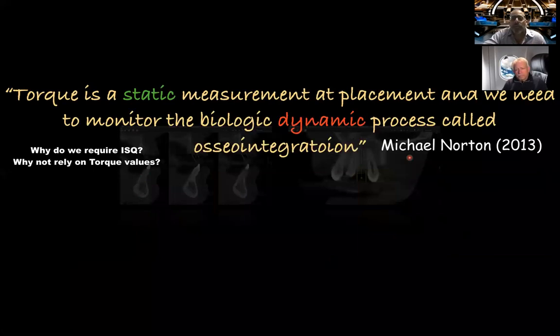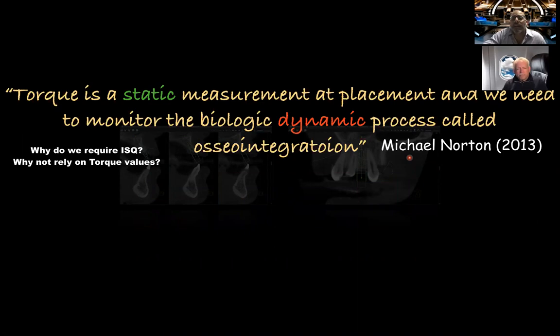As Michael Norton said in 2013, torque is a static measurement of placement, and we need to monitor the process of osseointegration, which is a dynamic process. This is not a static process. It's constantly changing. So we need to monitor it in a non-invasive way.